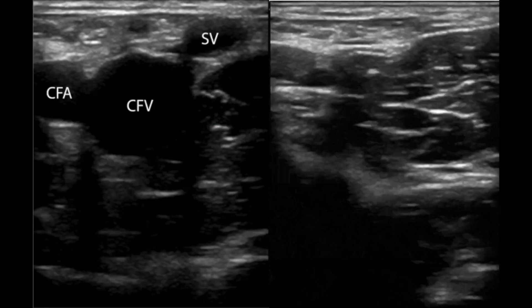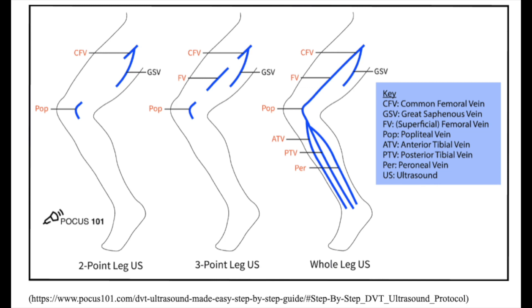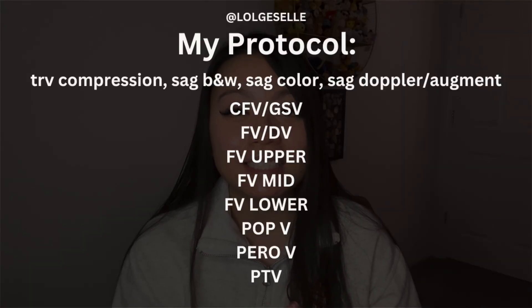You take one black and white compression picture — it's a dual screen, so you have one normal open vessel on one side and one compressed vessel on the other. You start at the common femoral junction with the greater saphenous vein and go down the leg. You take a black and white picture, a color picture, and a Doppler picture. Some places also do black and white in sagittal and transverse all the way through. What I do is four images: the compression in B&W, a sagittal in B&W, a color sagittal, and a Doppler.